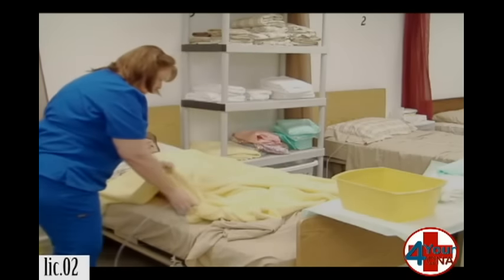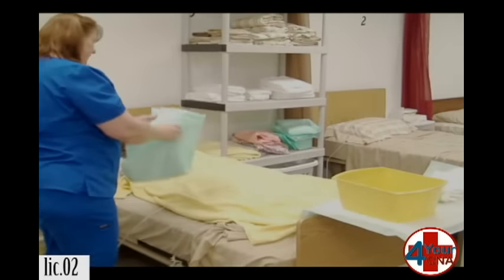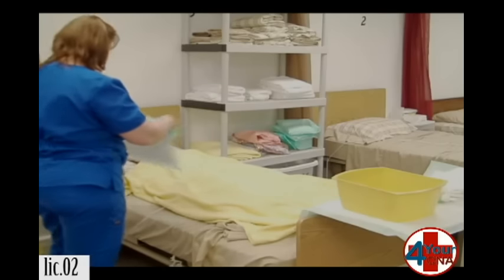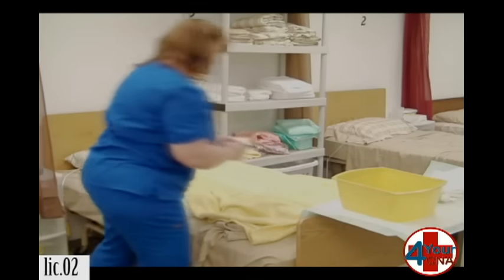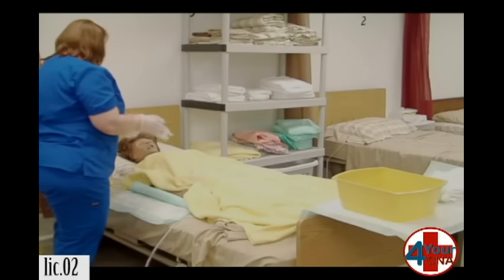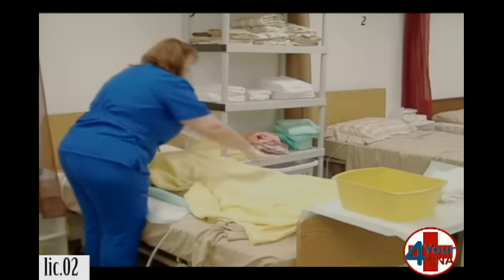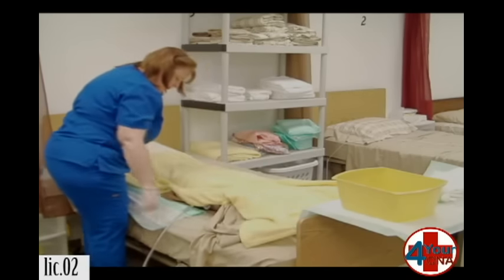Be careful not to grab that tubing as I do that. I'm going to place the chucks under you. This will help keep the bed dry while we clean you up. I'll get a pair of gloves. Now, in just a moment, I'm going to ask you to scoot toward me. We're going to roll you up on your left side and I'm going to place this barrier under you, okay?